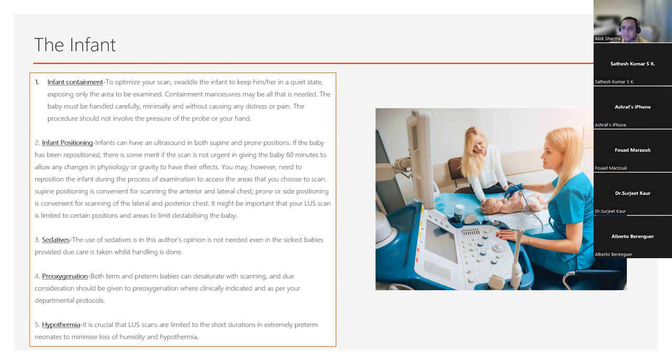So when you look at our colleagues in Paris, Nadia's group, they don't use chest x-rays at all. I think during the learning phase for all of you, chest x-ray is your fallback. It's your standard against which you're comparing your lung ultrasounds in order to make a diagnosis. As you become more experienced with it, as I've previously emphasized, you'll find that there are certain conditions where lung ultrasound is much more sensitive, where the pickup rate as compared to a chest x-ray, especially for small pneumothoraces, is much higher. And in that situation, after a period of 3 to 6 months, maybe 12 months, depending on your learning curve, you become more confident in being able to diagnose with or without a chest x-ray.